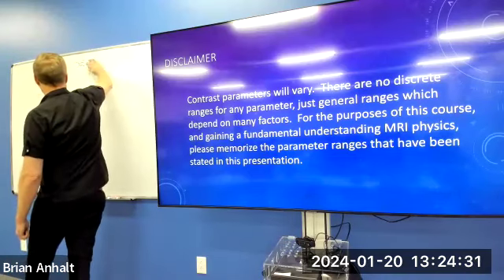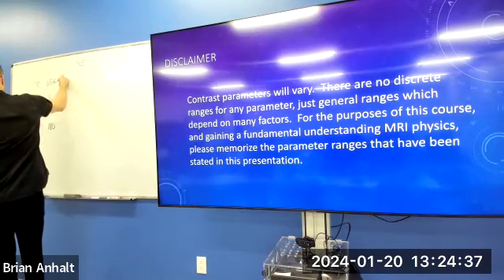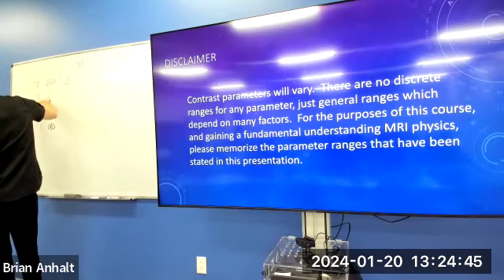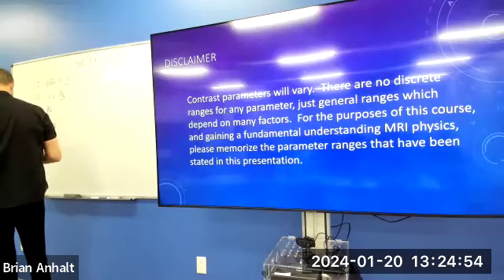It's still spin echo, right? That's the first thing you have to do. We know it can't be T2 star weighted. TR, short or long? Short. What has that done for us? Enhanced T1. Has this gotten rid of T2? Yes. It's short, so it has destroyed T2 information. Fat. It's a T1 weighted spin echo.